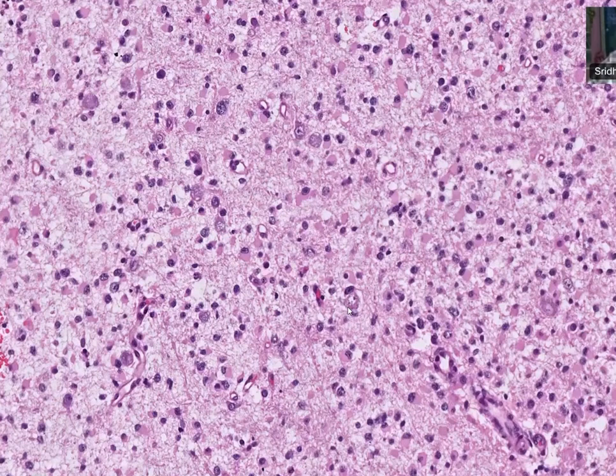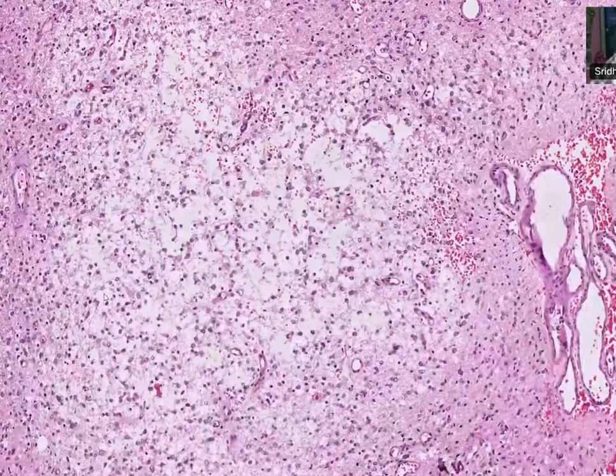So when you see tumor cellularity that is not monomorphic, and each cell is different from the other cell, that is the biggest feature of an astrocyte. Conventionally, when you describe an astrocytic cell, it's an elongated cell. You have an irregular nucleus. Sometimes you can have a plump, eosinophilic cytoplasm. The word gemistocytic should be reserved only for cells which have dense eosinophilic cytoplasm, like what you see here. These are the cells you saw on the previous screen. These are seen in various areas. There are some loose areas, and there are some compact areas.